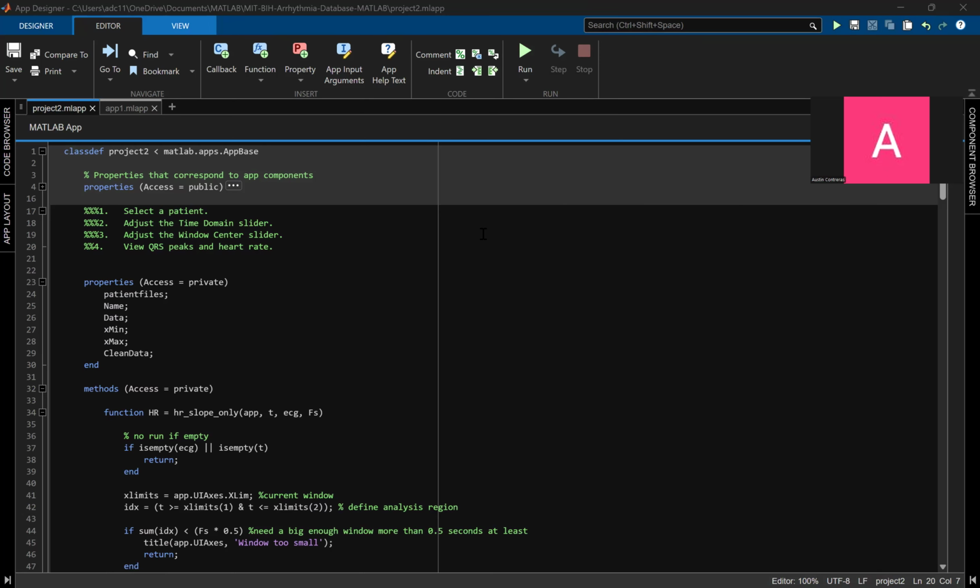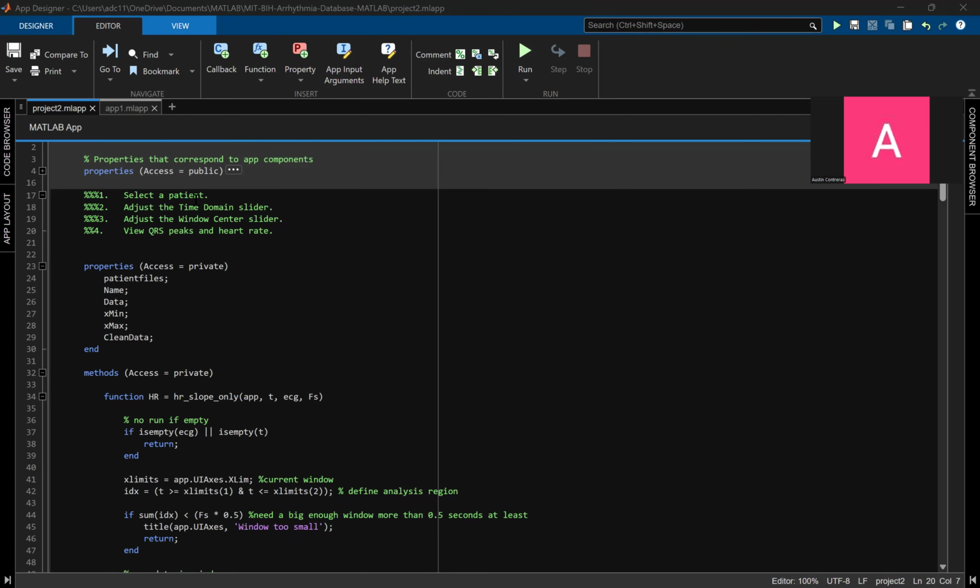Okay. Project 2, Austin Contreras, application of embedded systems, MATLAB, ECG, GUI. Code, that's my code. Just some instructions, very simple.